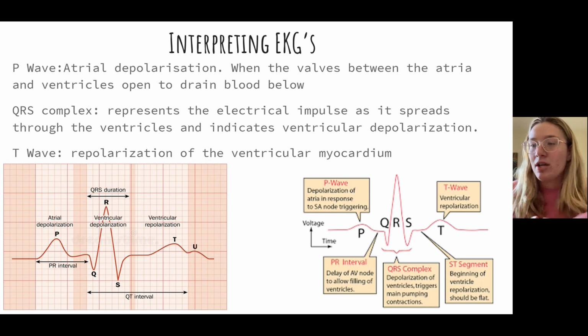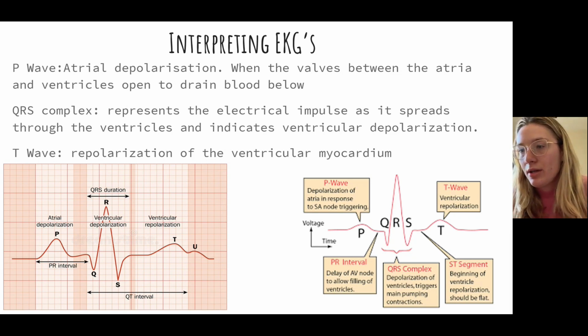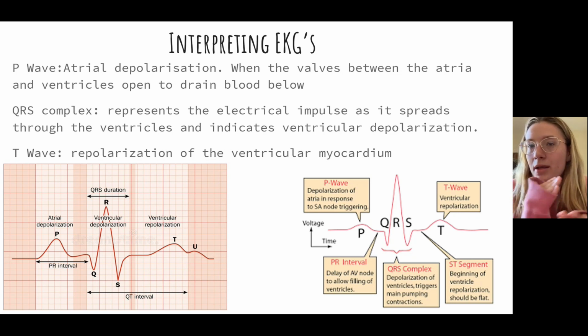Because remember, when we're talking in the grand scheme of things, systole is our squeezing. So our heart is squeezing blood out to the body. So when we hear that lub, this at the electrical level is what's happening. And then when we hear that dub, now we're closing and we're refilling, okay? And then the T wave, this is like our overall reset. So we reset and we repolarize everything and we're getting ready to go again.